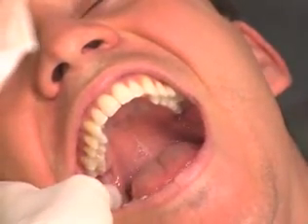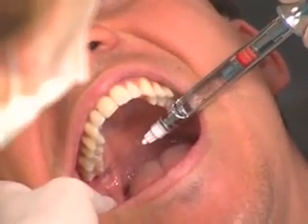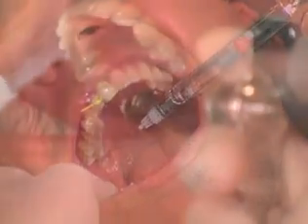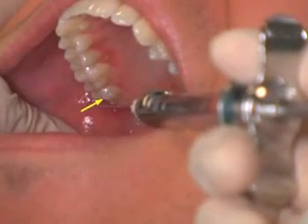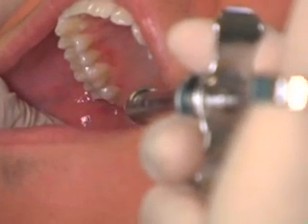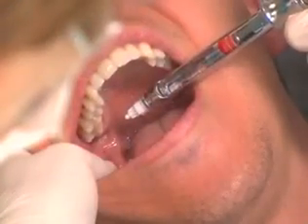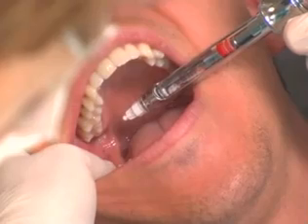The barrel of the syringe is placed in the corner of the mouth on the opposite side, and the needle tip is placed just below the mesiolingual cusp of the maxillary second molar. And then the needle tip is moved just distal to the second molar. This locates the insertion site for the Gow-Gates injection. The needle is now inserted until bone is contacted.